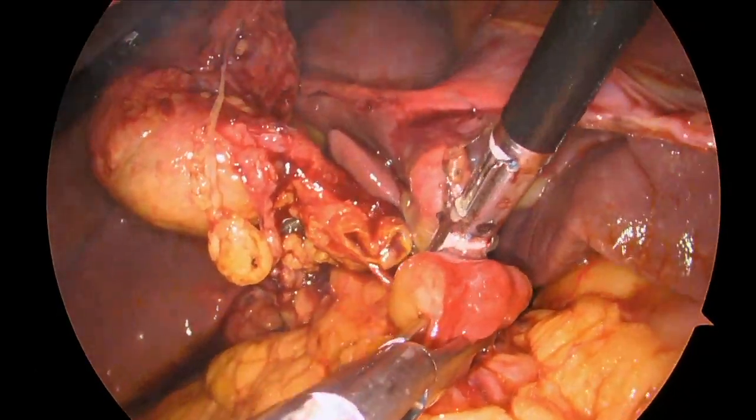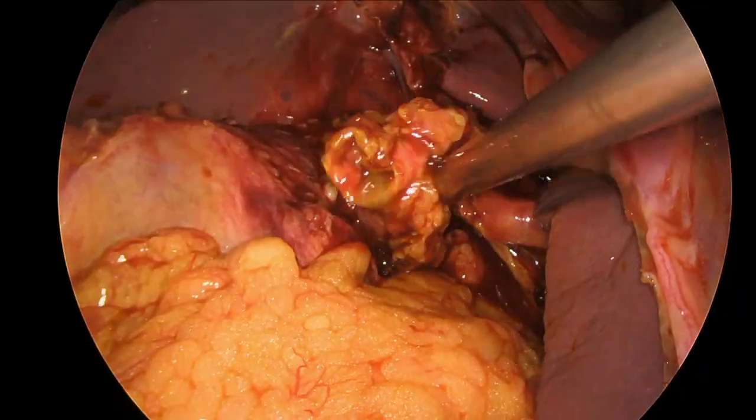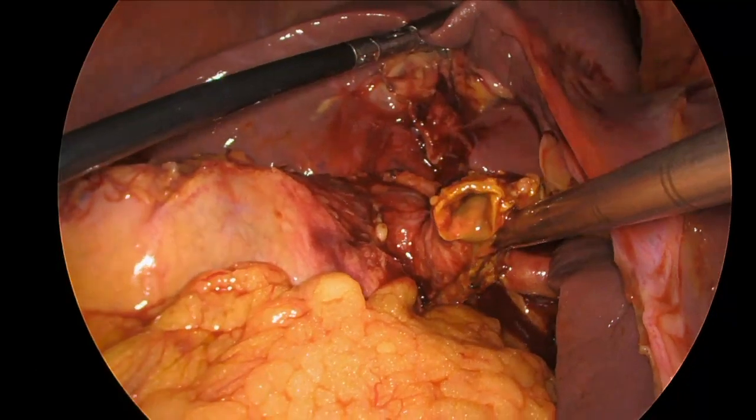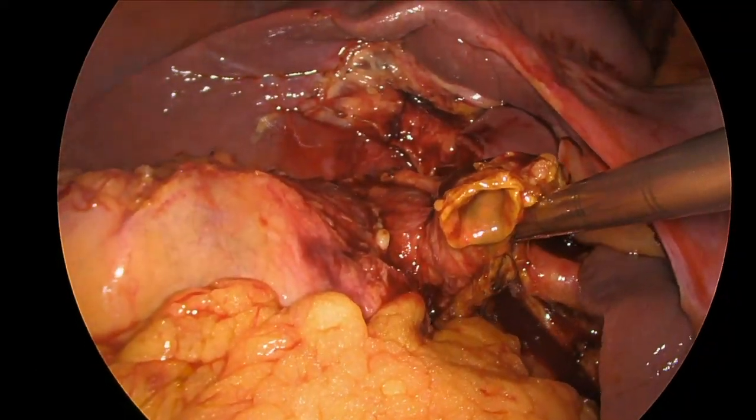The tissue was removed and moved out of the way so that we could fully assess the porta hepatis and the biliary tree. Here we can see the bile duct seems to have a decent lumen and there's lots of extra hepatic bile duct.